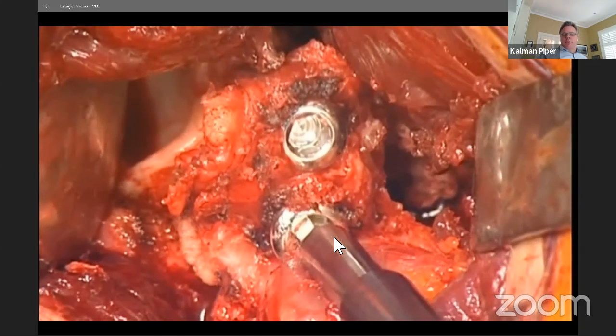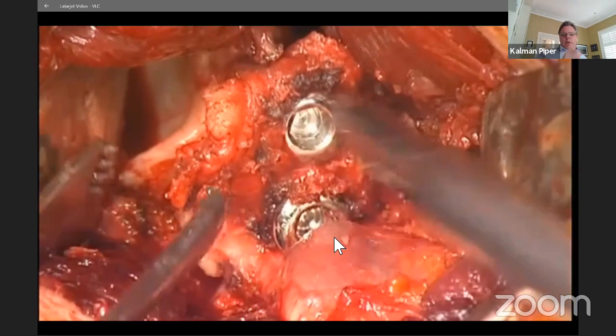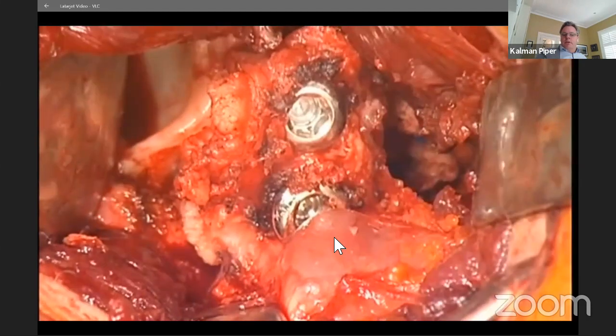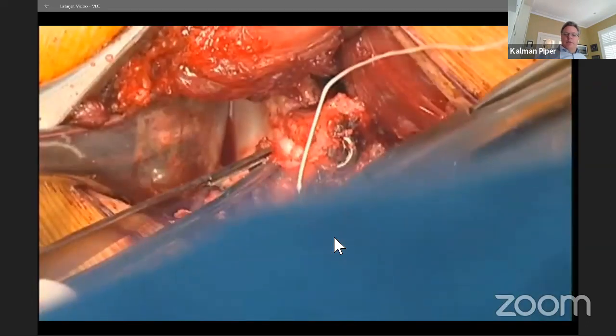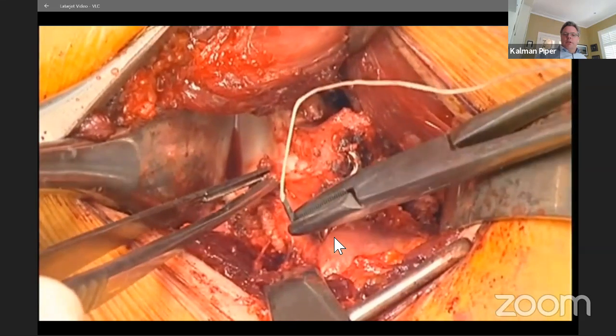And these are done just finger tight. You don't want to do them too tight. If you tighten them too much, firstly, the graft can start to medialize on the glenoid neck further, but if they're really over tightened, you can actually fracture the graft. The bone is not particularly hard, so just finger tight is plenty.